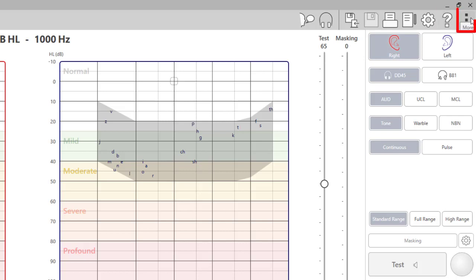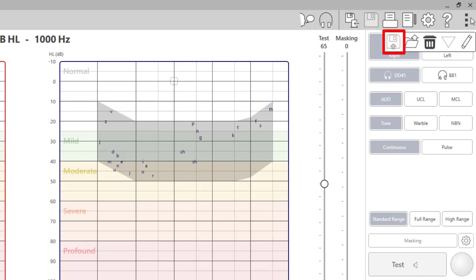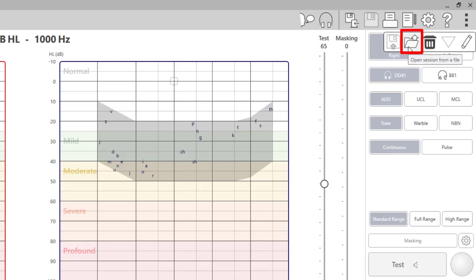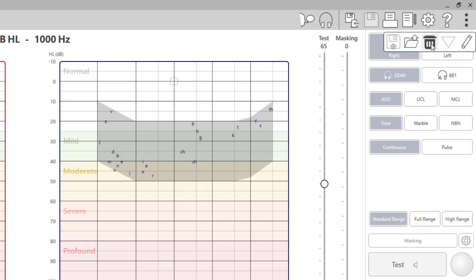The last icon is the more icon. From here, you can save the current session or open a session from a file. You can clear previous data for the current tests. The old sessions will be saved in the previous session. You are simply clearing the screen for the current test.